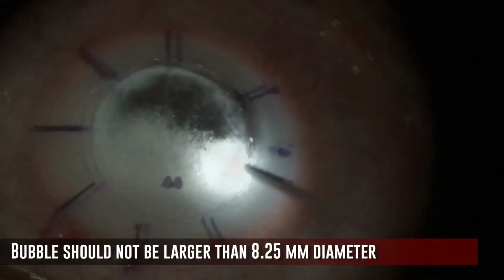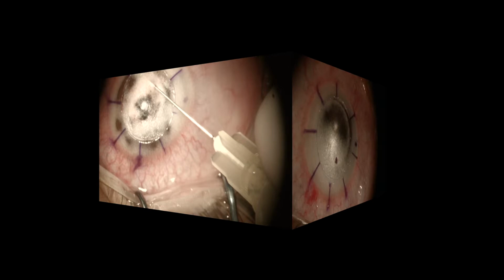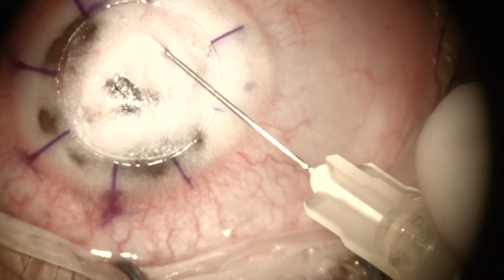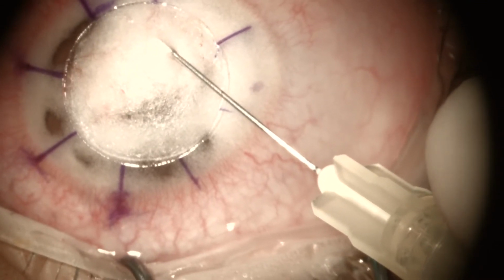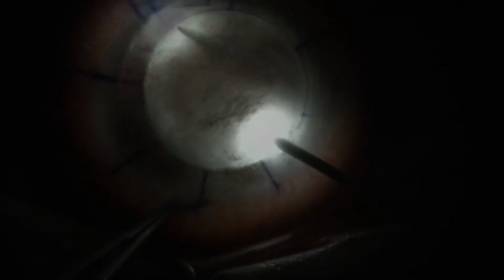The type 1 bubble should not be larger than 8.25 mm diameter. When do we use corneal transillumination? This technique is ideal to use when we can't see the big bubble under a complete white emphysematous cornea, like in this case where we can see the light bouncing inside the bubble due to light reflection. We can clearly see the full moon sign.